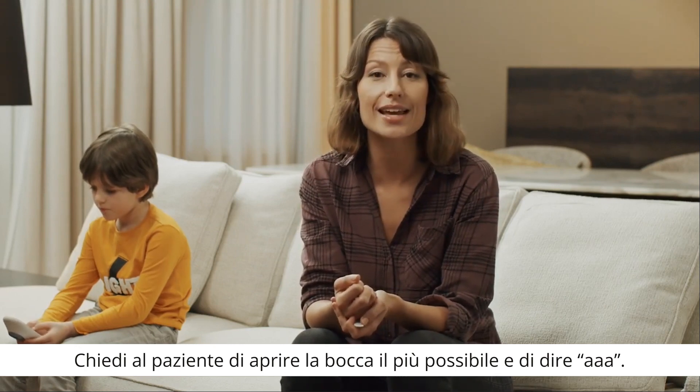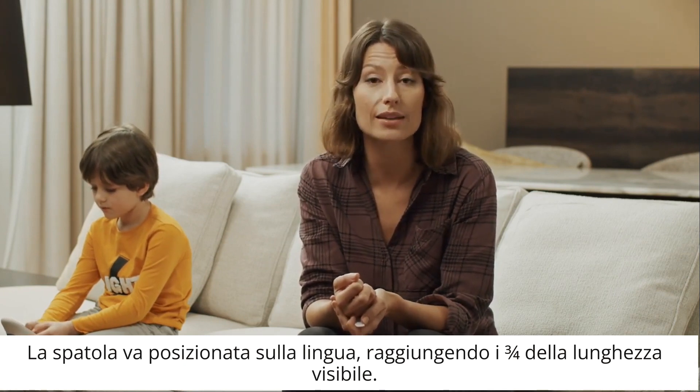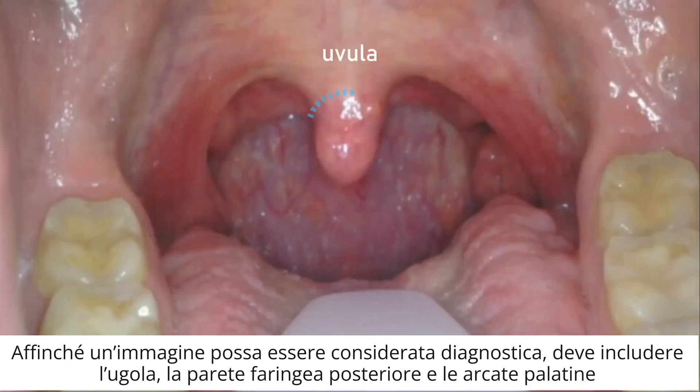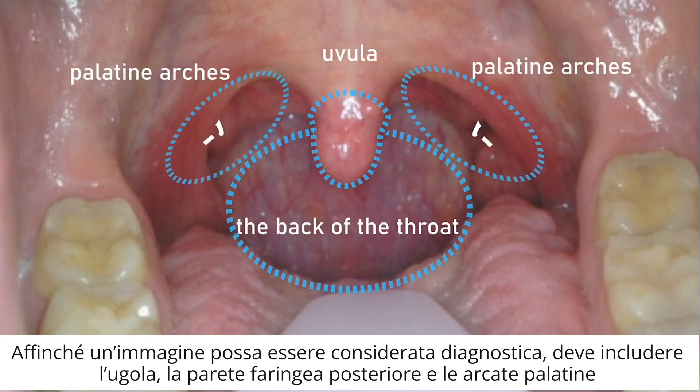Ask the patient to open his mouth as wide as possible and say "ah!" Place the spatula on the tongue reaching up to three-fourths of its visible length. In order for the image to be considered diagnostic, it should include the uvula, the back of the throat, and palatine arches.